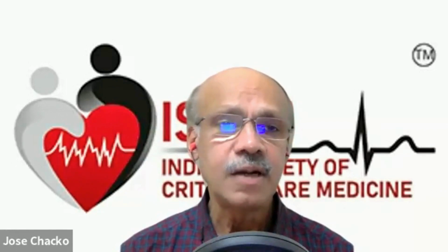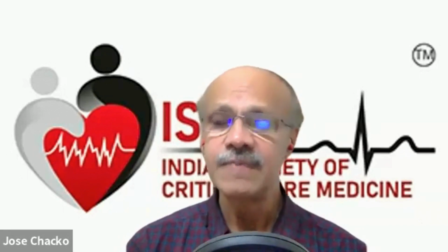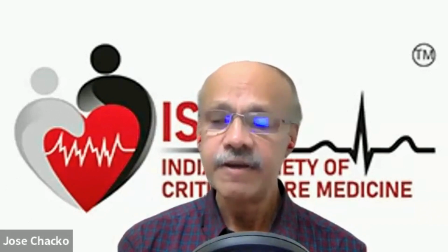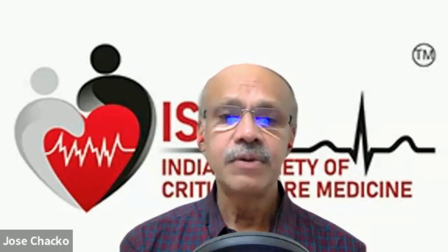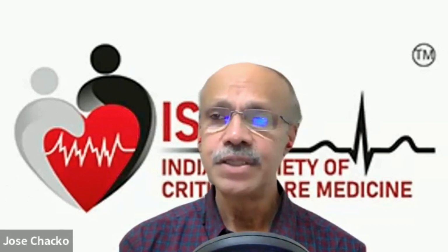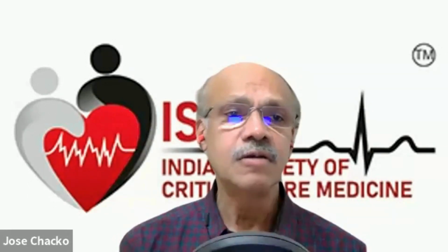So VTI alone would do, and the respiratory swing on the VTI waveform would also be a strong, powerful indicator of volume responsiveness in patients who do not have spontaneous respiratory efforts. So that applies only to patients who don't have spontaneous breathing, the VTI variation with respiration, like with other respiratory parameters. But, as I mentioned, VTI pre and post passive leg raise would give you a good indication regarding volume responsiveness in patients who are spontaneously breathing, as well as those who are on controlled ventilation.